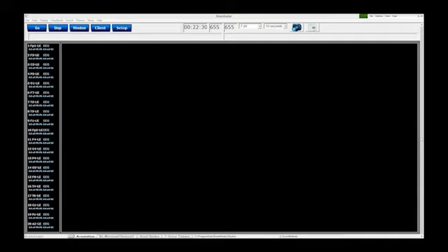Can you use voxels in the non-LORETA protocols? You absolutely can, Dan or Debbie. Voxels actually come in two forms, and we do have a Surface Z-score that does region of interest training to the amplitude setting.